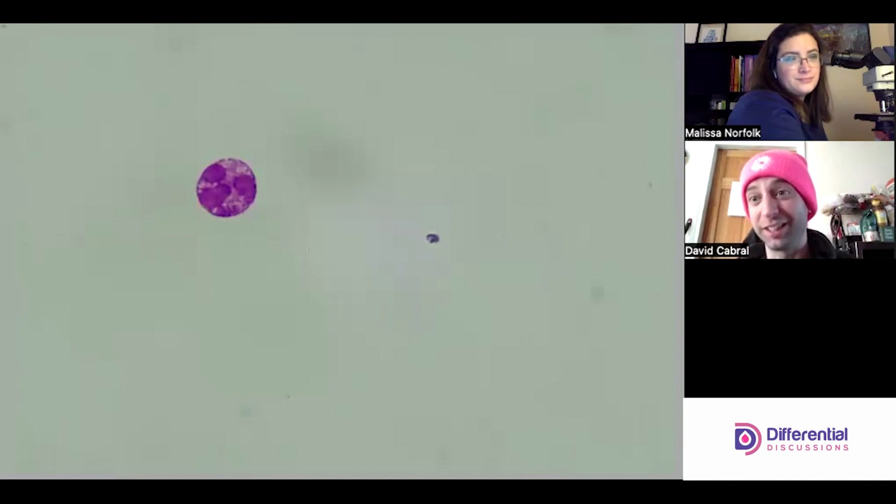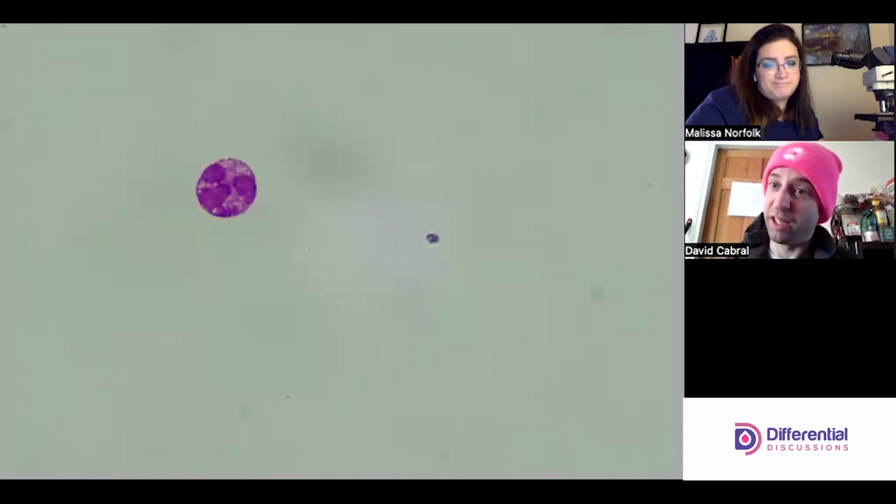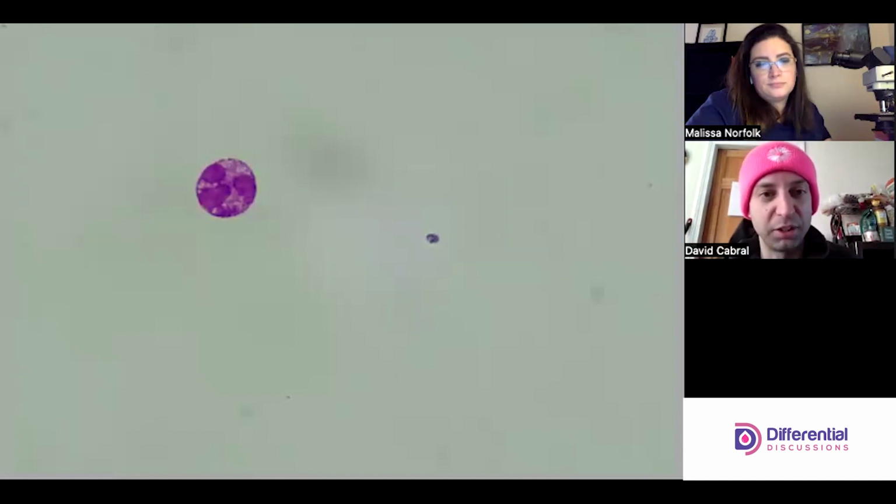That's a big signal, right? Run through the segmented white cells that are physiologically part of humans. It can't be a neutrophil because of the variation. The color is off for it to be an eo, right? So you're just left with baso as the best choice.